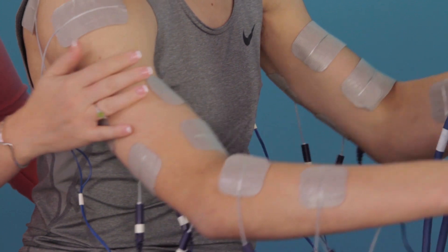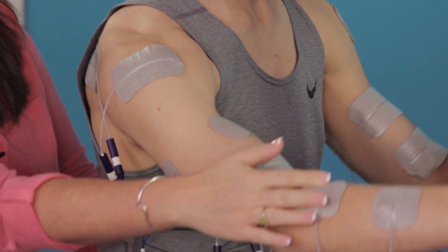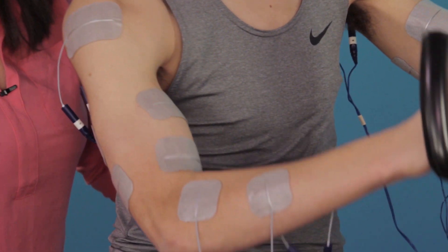FES can be delivered continuously to stabilize joints prior to crank rotation, for example to ensure shoulder safety.